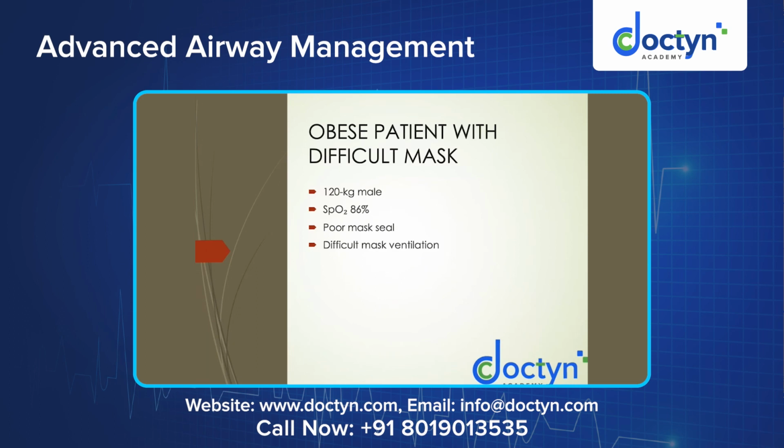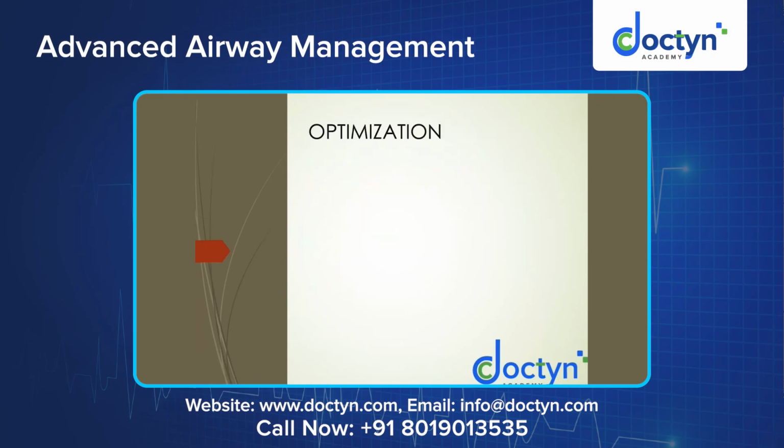Next, an obese patient with difficult mask. He's 120 kg, saturation is 86%, poor mask seal. As we said, what would be the best approach here? Difficult mask ventilation is there. How do you optimize it? You use a ramped up position, number one. Number two, two-person bag mask ventilation. Even if it is difficult, you try to optimize it by insertion of an oropharyngeal airway. The next steps: if bag and mask ventilation is still poor even with oropharyngeal airway insertion, as we discussed, you try to insert a supraglottic airway, maintain oxygenation, optimize the oxygenation, and then you try intubation.